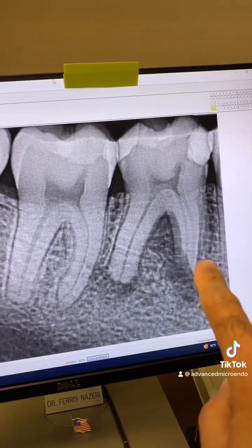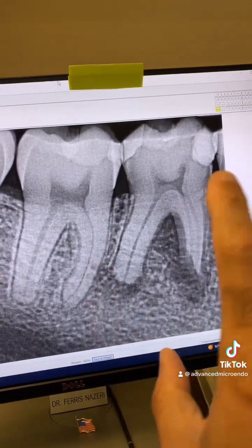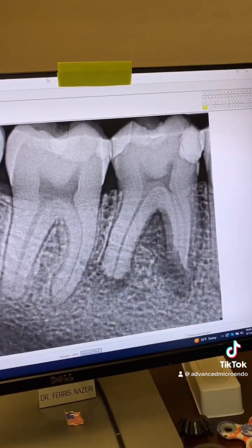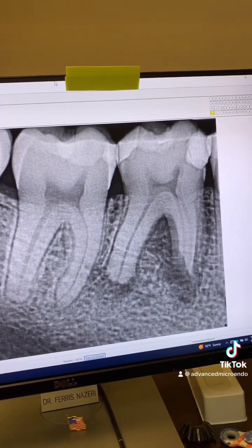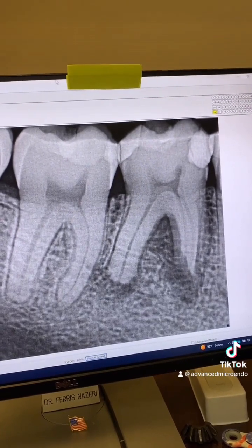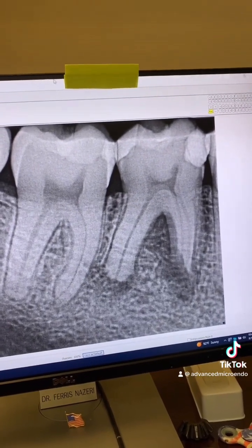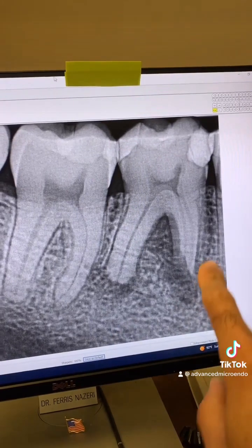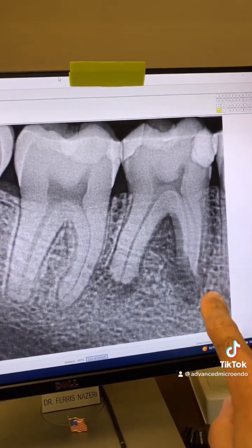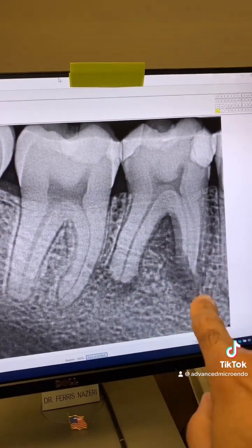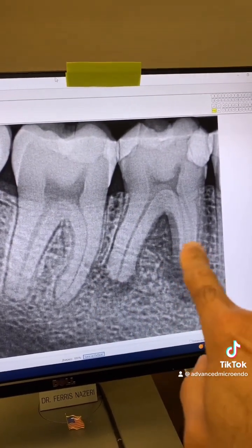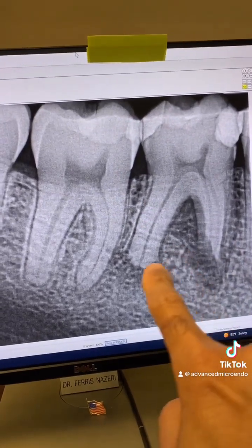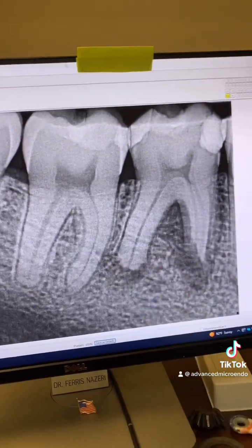You can see peripheral lucency here and here. He said he had a swelling on his gum, and he popped it on his own a few days ago, and I could see the remnant of it. You can also see all of that root resorption on the distal as well.